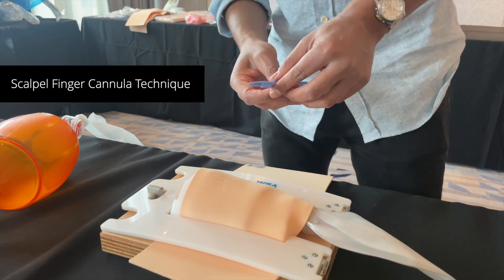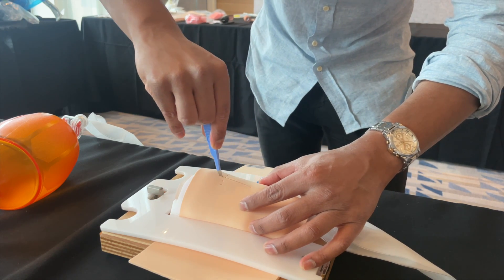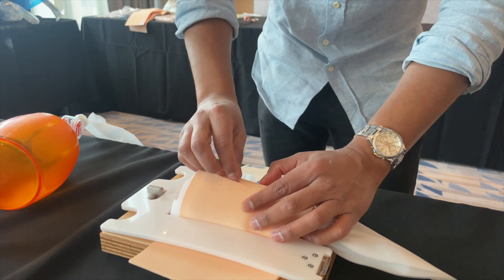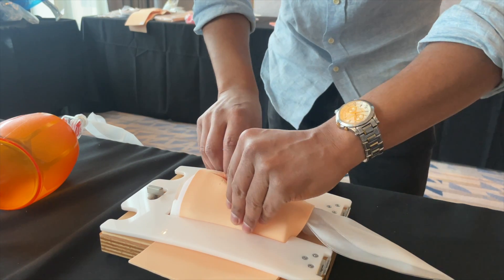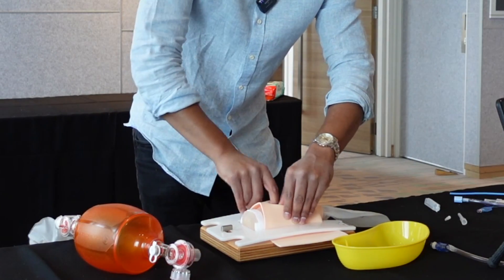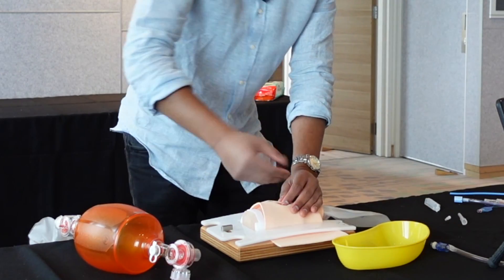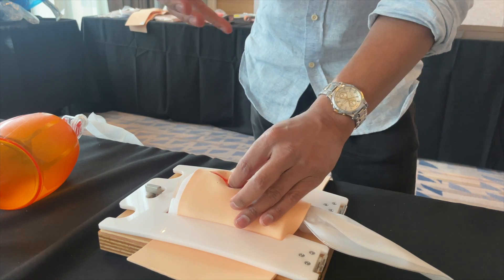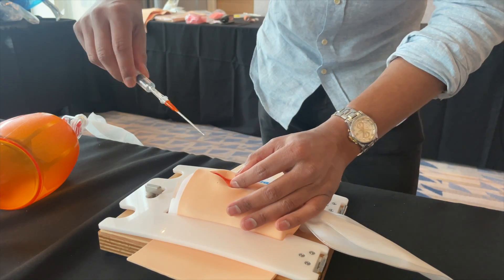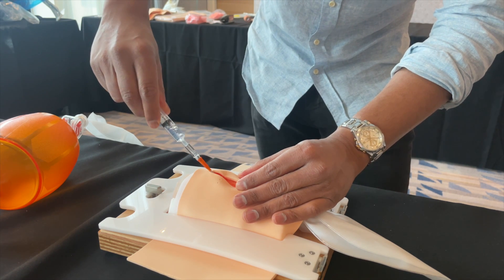If that fails, I take my scalpel and make an incision about six centimeters down what I perceive is the midline. There's going to be some blood, so I need gauze to stop the bleeding. I then use my gloved fingers in as sterile a fashion as possible to divide the muscles and try to feel something familiar. At this point, I've gone from a quite large neck to something where I can feel the anatomy. Then again I use my needle crike technique and get that positive aspiration of air.